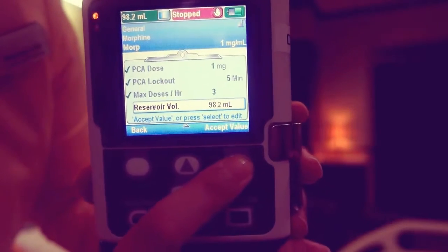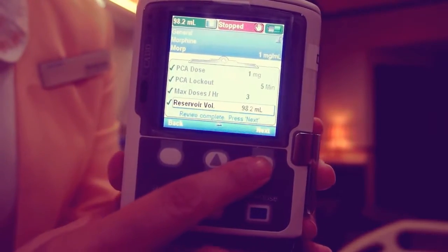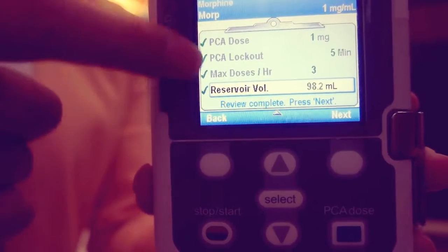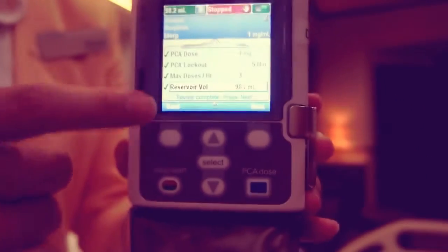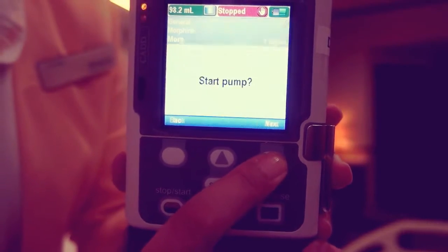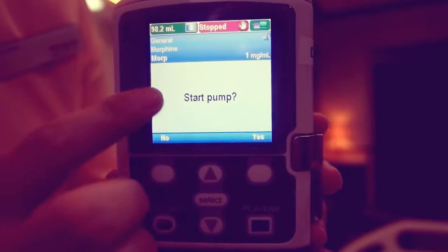Continue until all patient's specific parameters have been reviewed, accepted, and displayed checkmarks. Press next. Start pump displays. Then press yes.